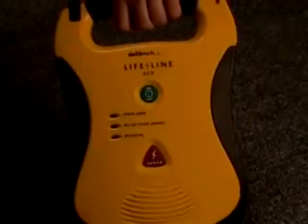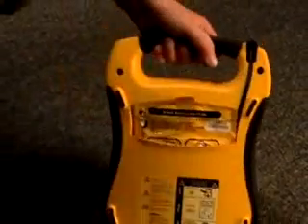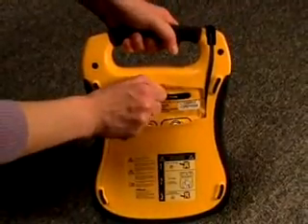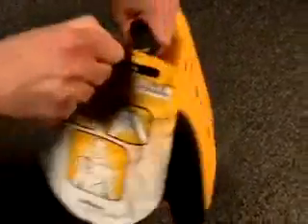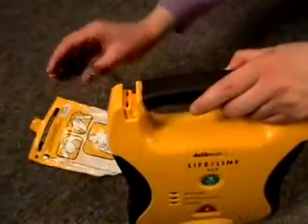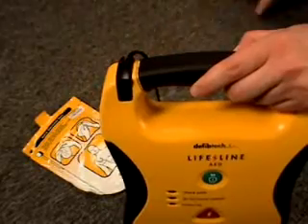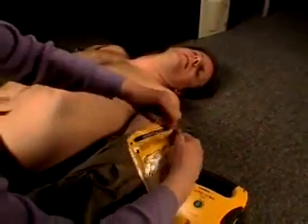The Lifeline AED should have been stored with the pads already pre-connected and in the pad storage pouch on the back of the unit. Remove the pad package by pulling on the tab on the pouch. If the pads are not already pre-connected, connect them by inserting the pad connector into the top left corner of the AED. Remove the pads from the package by tearing along the dotted line and follow the instructions printed on the package.